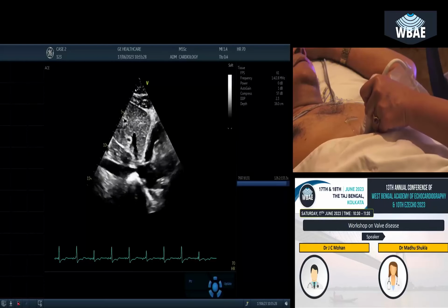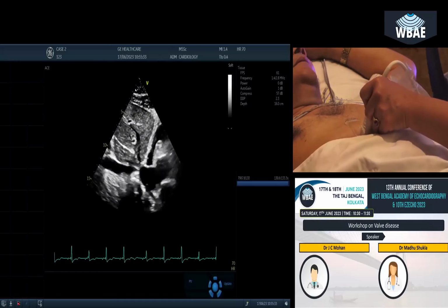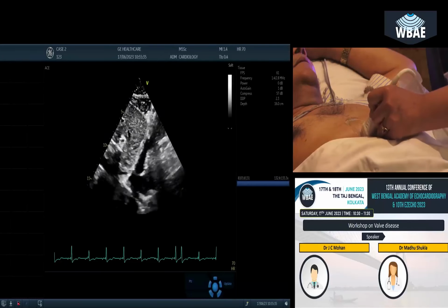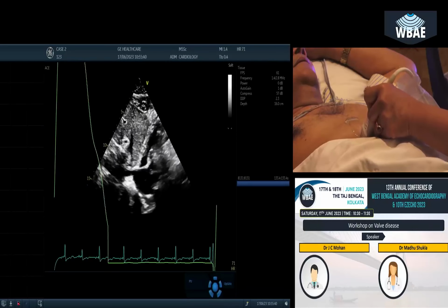But anyhow, whenever we look at the inferior vena cava, we always try to put a respirometer. Can we do that? Yes. So we'll have another physiological parameter besides the ECG.